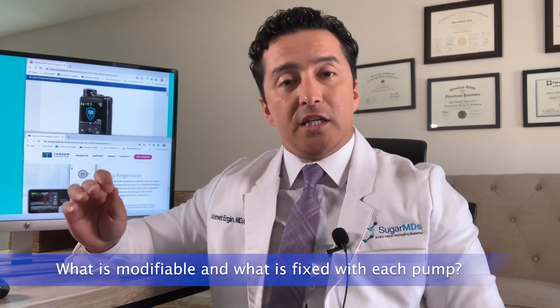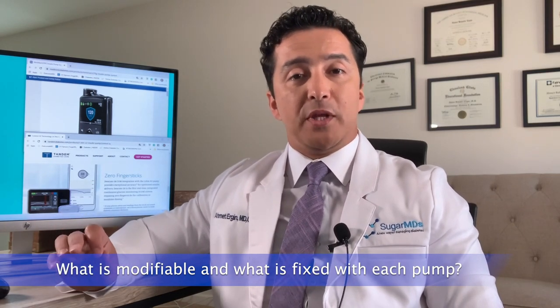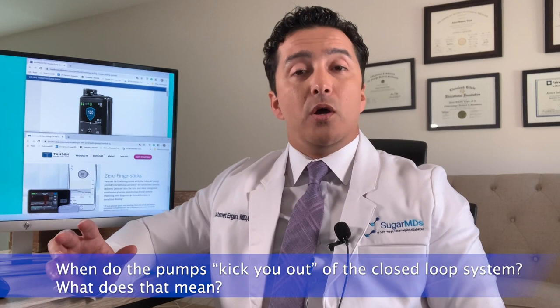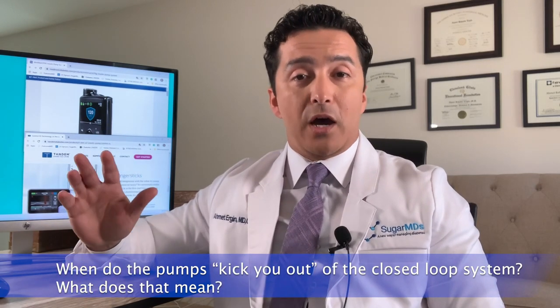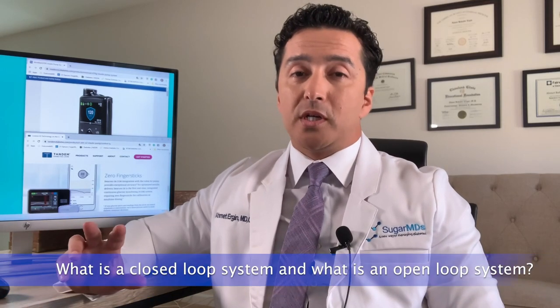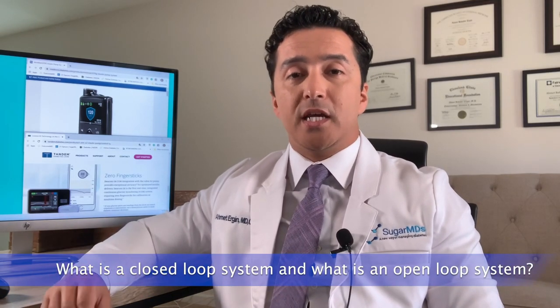Secondly, we will talk about what is modifiable and what is fixed in those insulin pumps. Thirdly, we are going to talk about when the pump kicks you out of the closed loop system — and we will explain what a closed loop versus open loop system is.